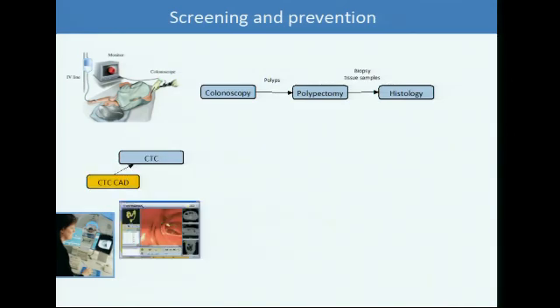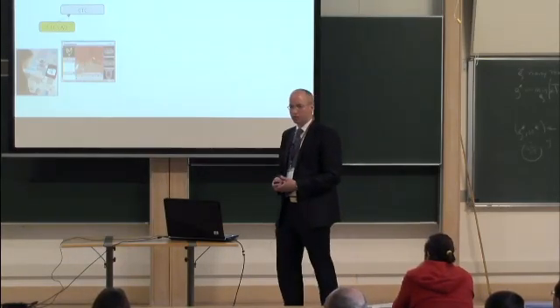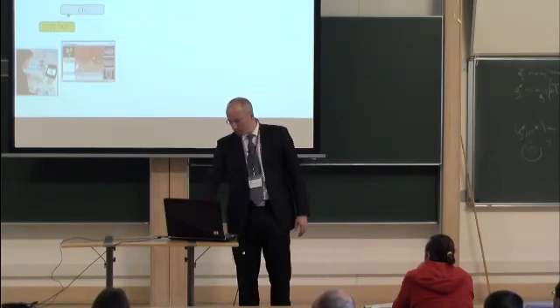So I mentioned CTC. At MedicSite, we're working on CAD, computer-aided detection. So we're applying pattern recognition algorithms to the medical images to identify automatically any potential polyps. These are then relayed to the radiologist reviewing the scan, and they can then examine the CAD marks and determine whether it truly is a polyp or a false positive.